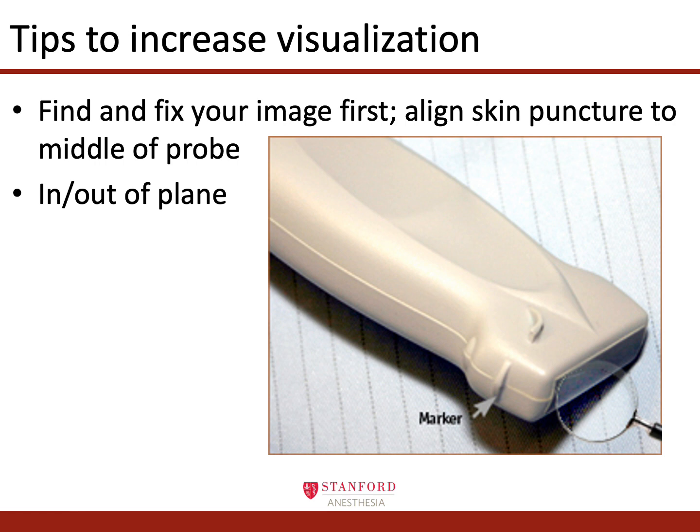In general, it is safer, more effective, and quicker to find and optimize the target image first and then introduce the needle into that image, rather than to change the image to optimize the needle visualization. And we will go through tips to increase the visualization of the target on the next slide.